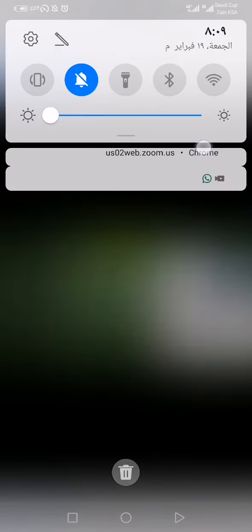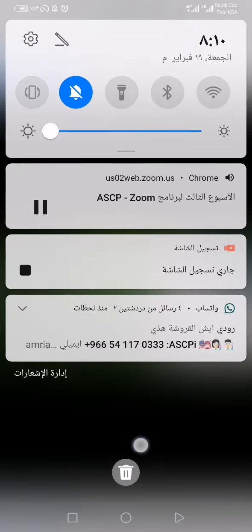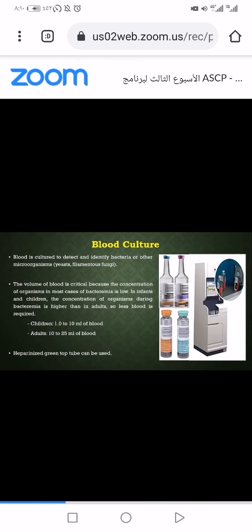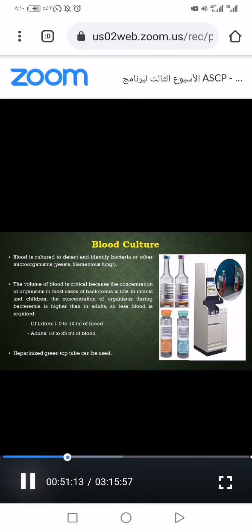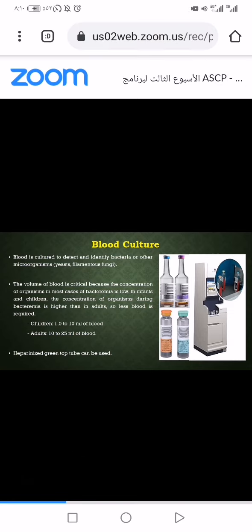فممكن تطلع خلال 6 ساعات، 8 ساعات، يوم. هذا أصلا بيعطي الدكتور كيف كمية الانفكشن. وعنده هاي انفكشن كانت كمية الانفكشن مرة مرتفعة، عشان كذا على طول طلع بوزيتيف، ولا لا يبغى له وقت طويل عشان يطلع بوزيتيف. طبعا هذه الأمور لازم تنحكم من ناحية ترانسبورتنج، من وقت ما نقلوها فورا نقلوها، من وقت ما جمع علينا فورا جابوها عندنا، هل نحن في المختبر فورا استقبلناها فورا حطيناها بالانكيبيتر، فهذه كلها العوامل تلعب دور.